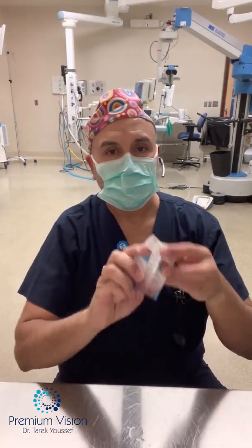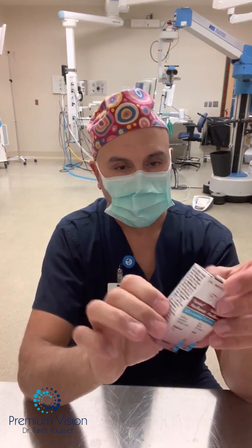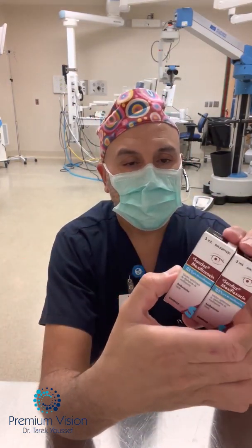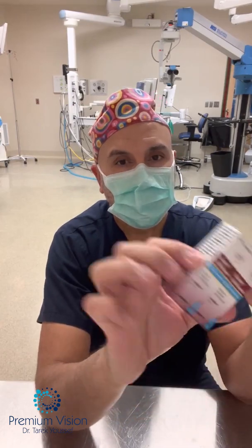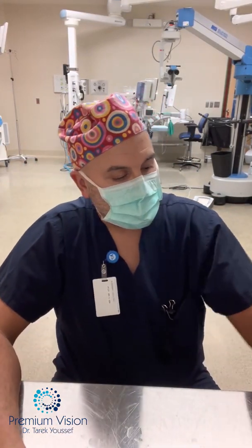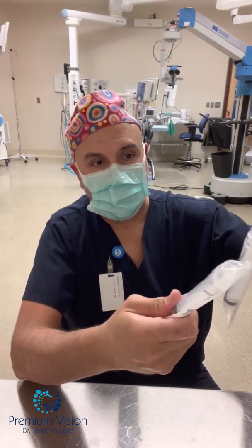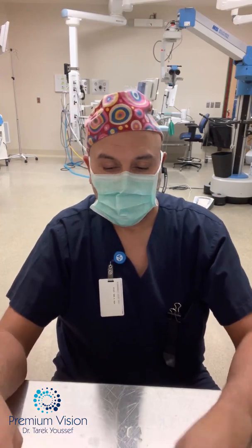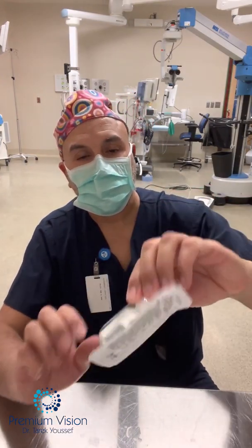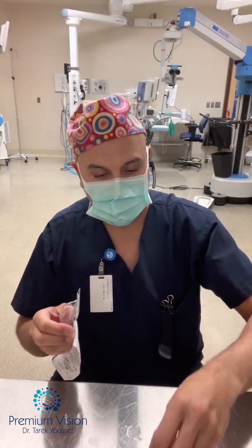I'm going to prepare the moxifloxacin — we use the vials into cannulas. These are the moxifloxacin vials from Sandoz. You can use the Alcon brand, but make sure it's preservative-free and don't change the types, because otherwise you can get toxicity issues. You need 10cc syringes and this 15ml BSS bottle. I'll open this — it's good for two syringes.